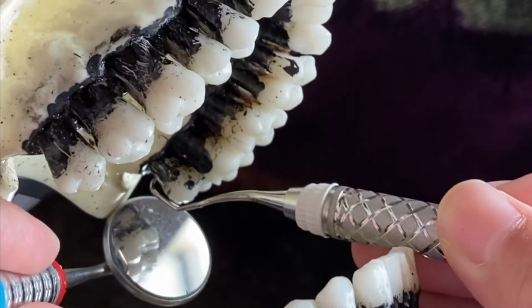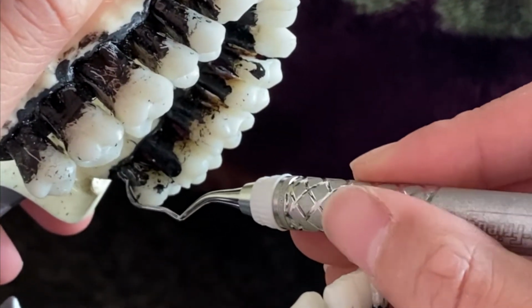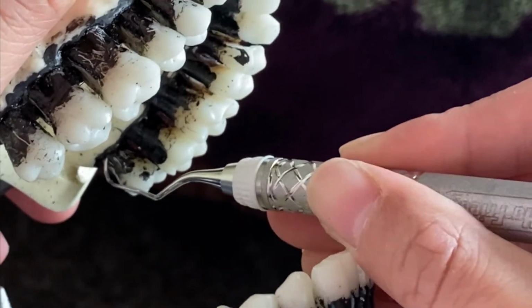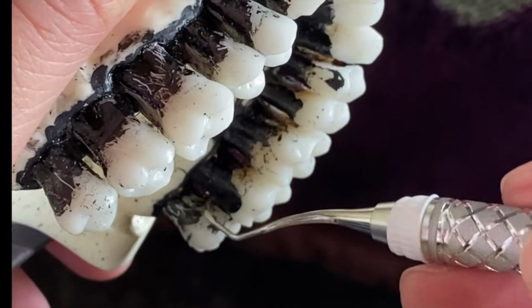Now for the lingual surface, I'll have my patient look over to the left, and I'll be sitting at 8 o'clock to 9 o'clock, using the same technique as used on the facial surface.